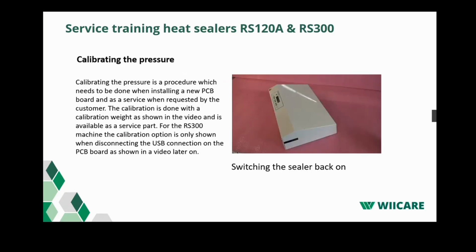Now we're coming to the next part. That's calibrating the pressure. Calibrating the pressure is a procedure which needs to be done when installing a new PCB board and as a service when requested by the customers. The calibration is done with the calibration weight, which you'll also see in the video, which will be played in a minute. For the RS300 machines, the calibration option is only shown when you disconnect the USB connection on the PCB board. So that's what I just explained.